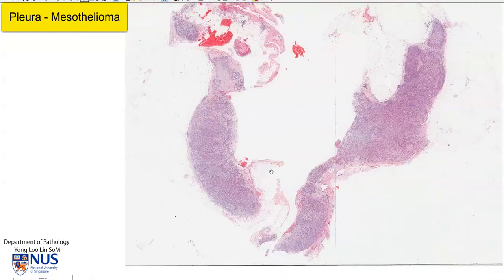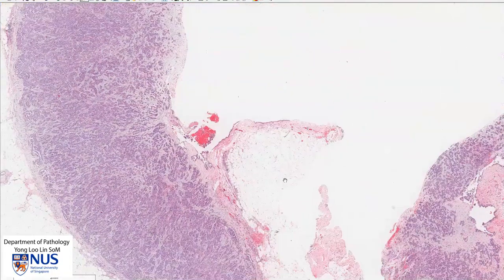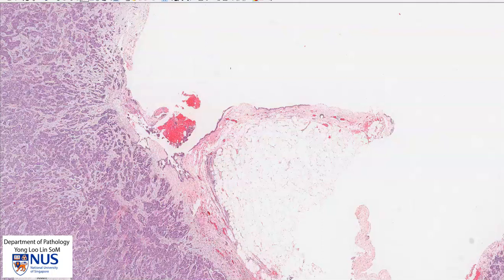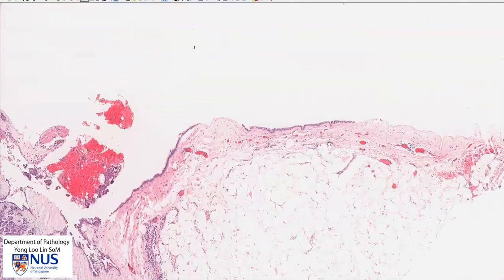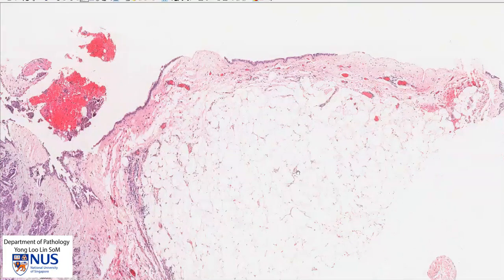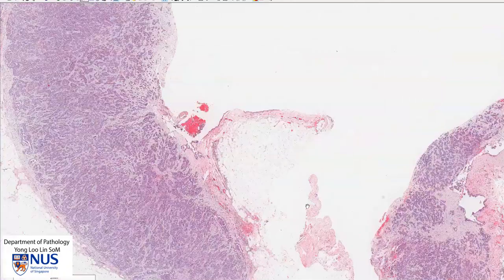Let's first have a very quick recap of the normal histology of the pleura. In the parietal pleura, normally it is lined by a single layer of mesothelial cells that are very bland looking, and underlying that is some fibroelastic stroma. We can also see blood vessels within the stroma, and underlying this is some adipose tissue. Sometimes if the biopsy is taken more deeply, we can also see skeletal muscle of the chest wall.